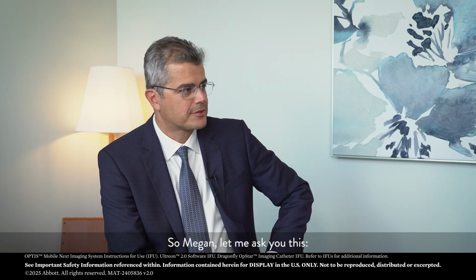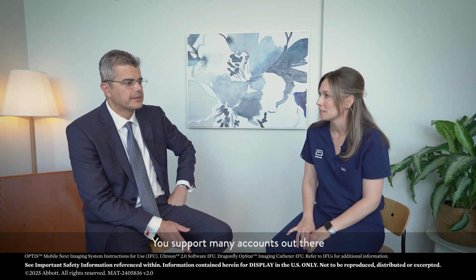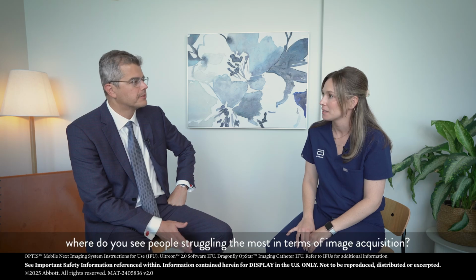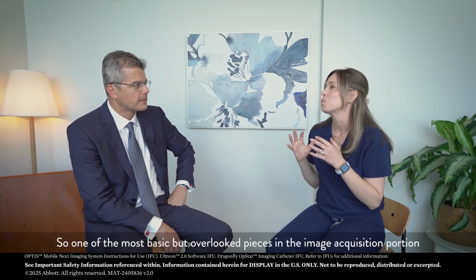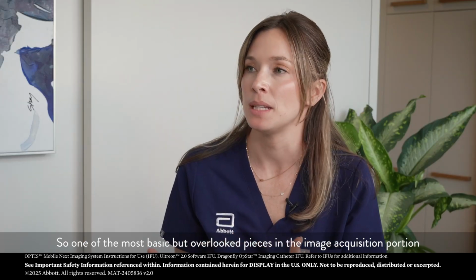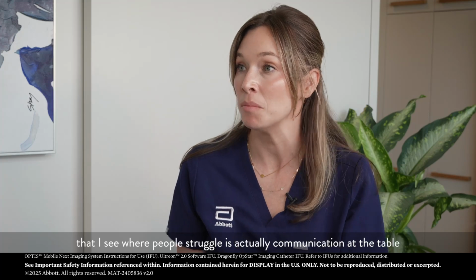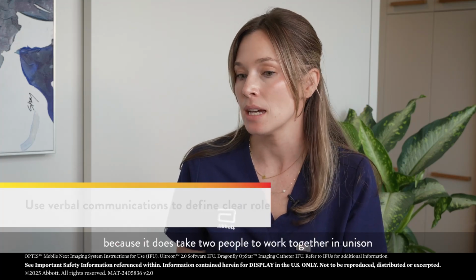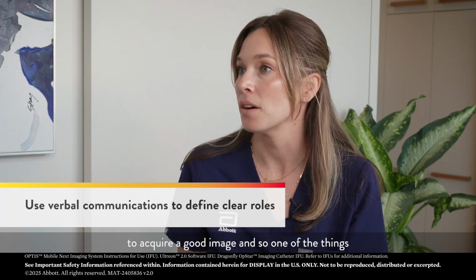So Megan, let me ask you this. You support many accounts out there. Where do you see people struggling the most in terms of image acquisition? So one of the most basic but overlooked pieces in image acquisition that I see where people struggle is actually communication at the table, because it does take two people working together in unison to acquire a good image.